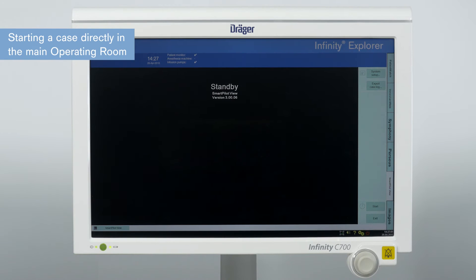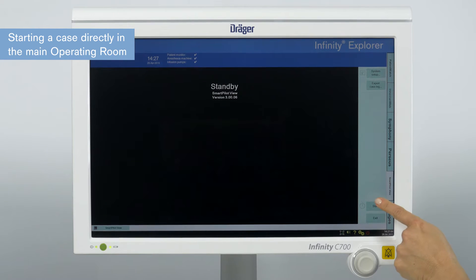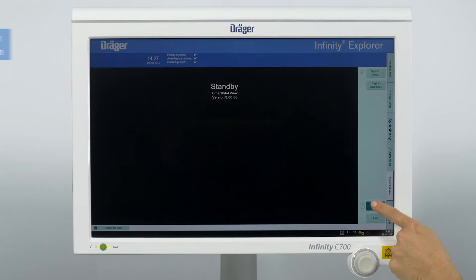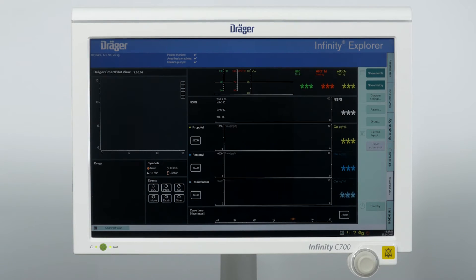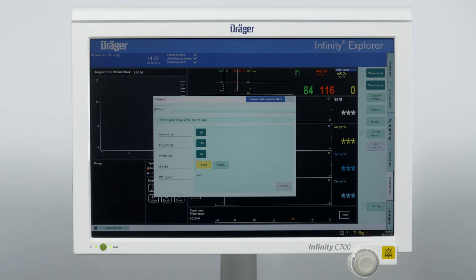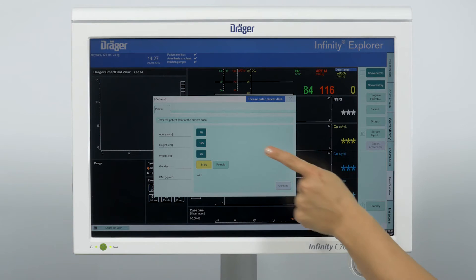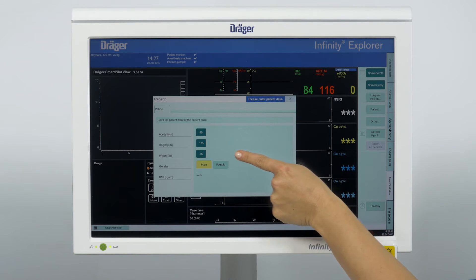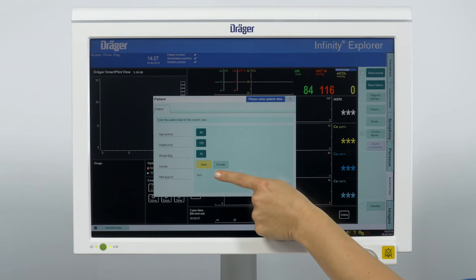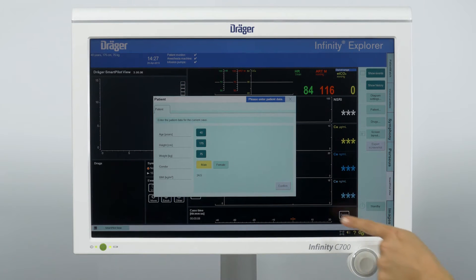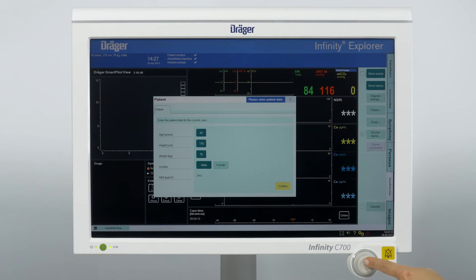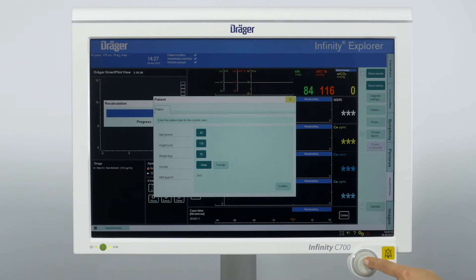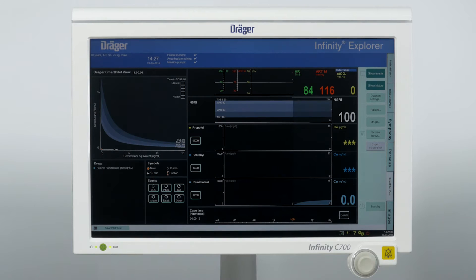Switch from standby mode to operation mode by pressing the start button. A patient dialog window will appear. Adjust the patient's demographic information such as age, height, weight, and gender. Body mass index will be automatically calculated. Press the confirm button and close the window.